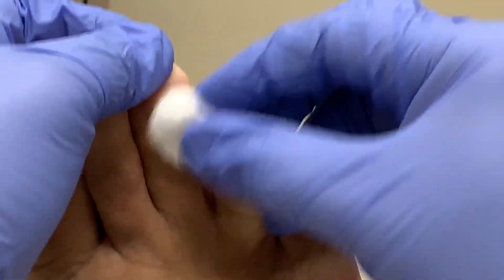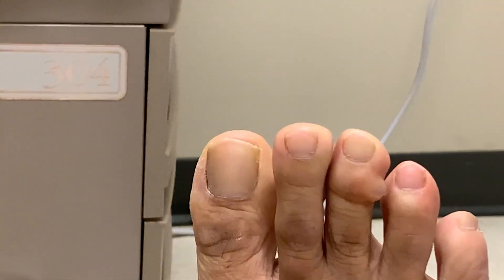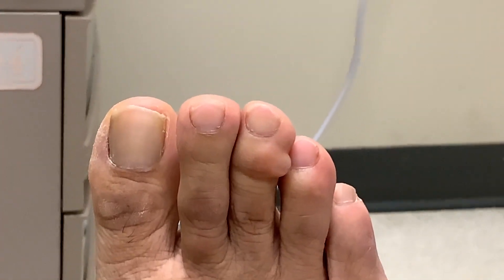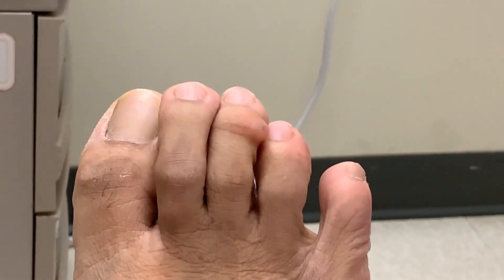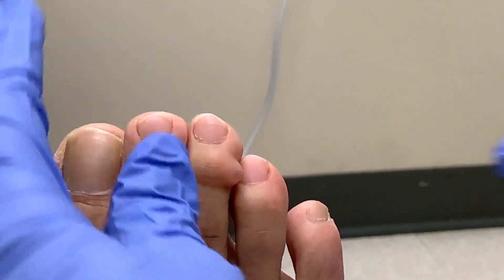The first thing my doctor does is clean and sterilize the area. No need to numb the area because it doesn't hurt. Then my doctor prepares a proper-size needle to puncture the cyst. If you don't have a strong stomach you may want to look away, but I find it fascinating.